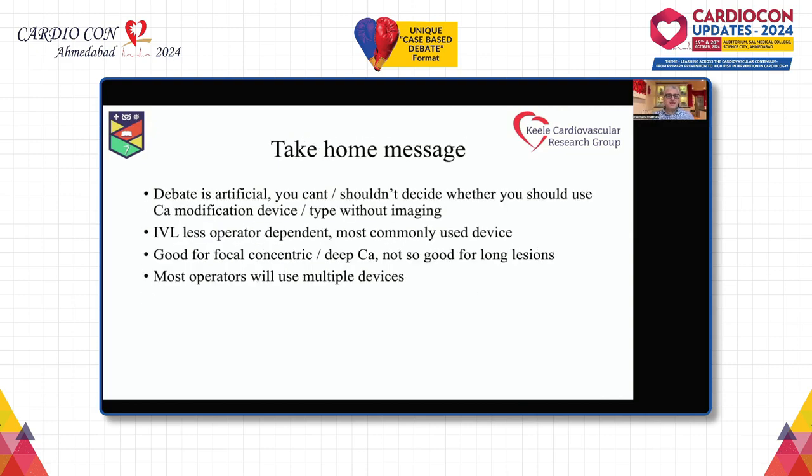So in my view, here are the take-home messages. I think the debate is artificial. You certainly can't and shouldn't decide whether you should use a calcium modification device and what type of device to use without imaging. So from the description of the case, it may be more appropriate to use orbital atherectomy. It may be more appropriate to use rotational. It may be more appropriate to use IVL. It may be more appropriate to use nothing at all. You simply don't know unless you do imaging.